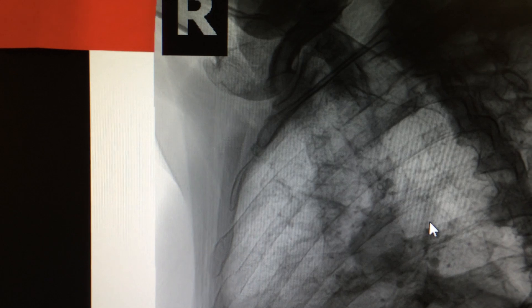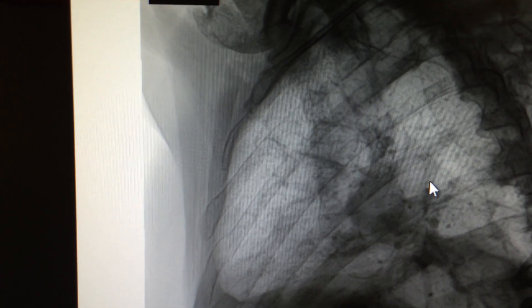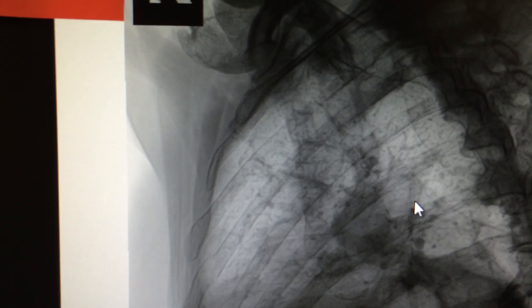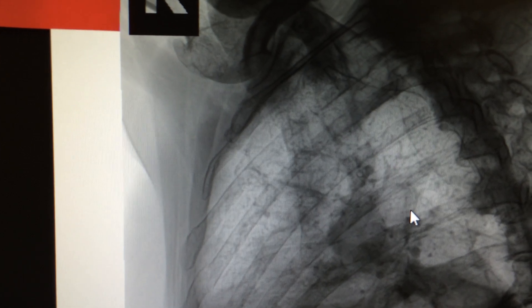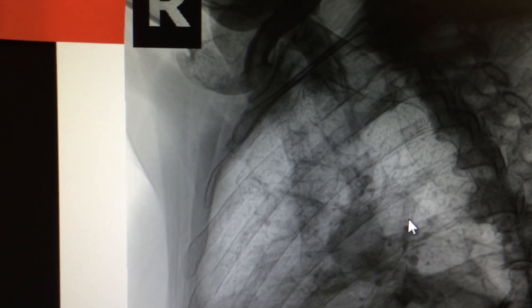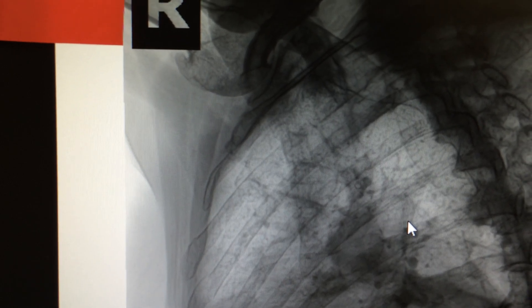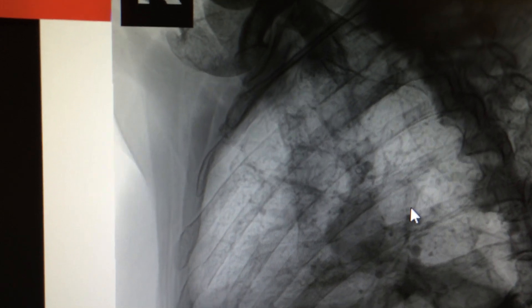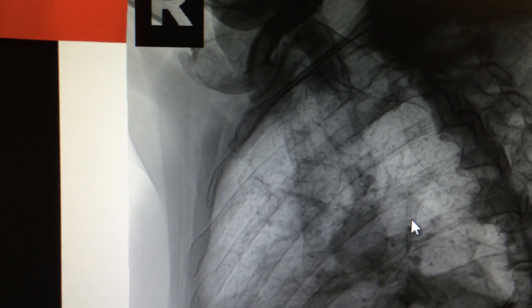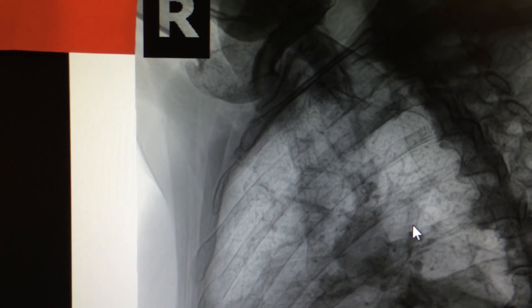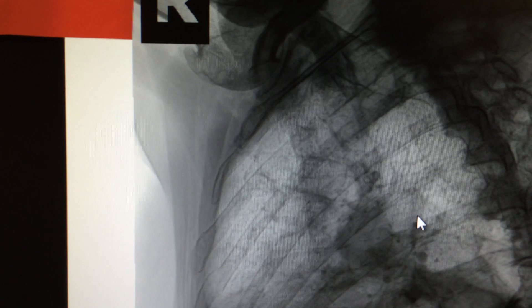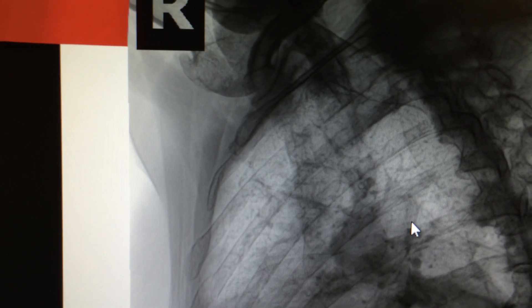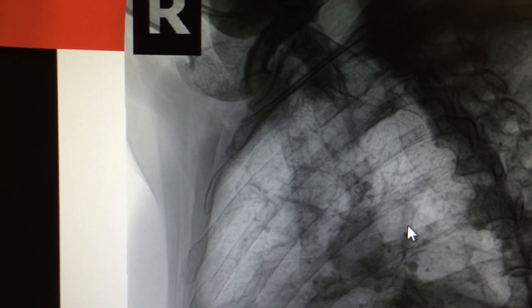Lower rib fractures are more commonly associated with injuries to the diaphragm, liver, and spleen. Just think in terms of anatomy — consider what organs lie under those lower ribs: diaphragm, liver, and spleen. The most common mechanism causing rib fractures is blunt trauma, which exerts direct pressure on the rib causing it to break.